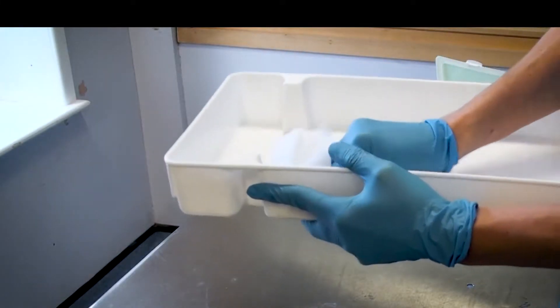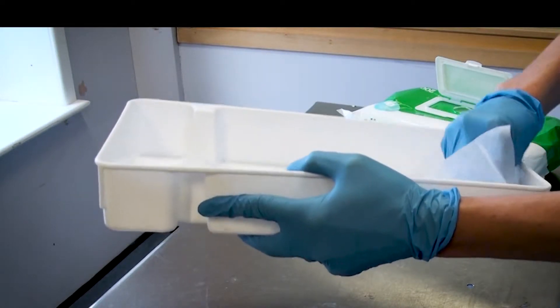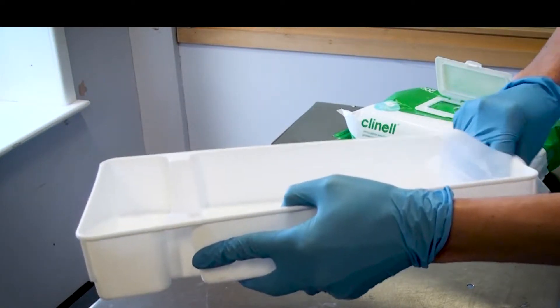Prior to assembling your tray, you must ensure that the tray has been thoroughly cleaned with the appropriate alcohol wipes and dried thoroughly prior to opening the packages.